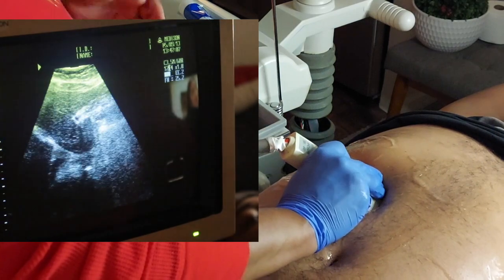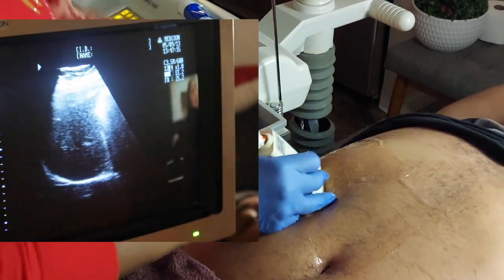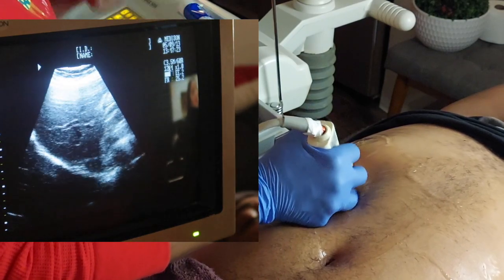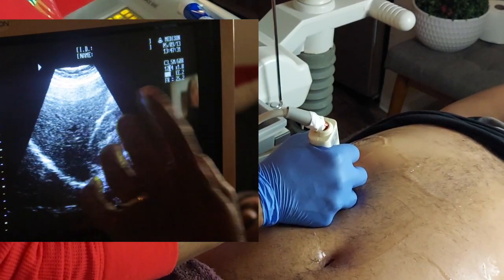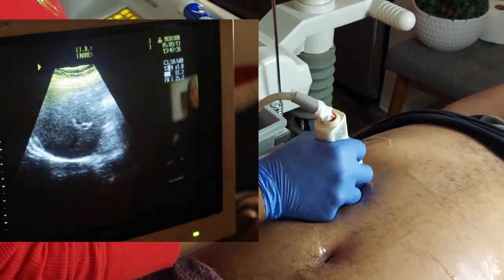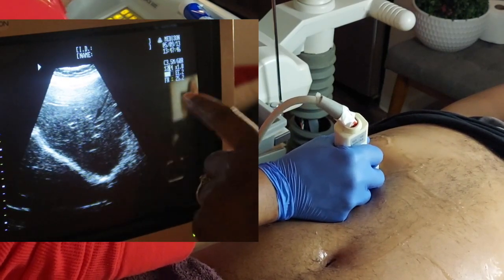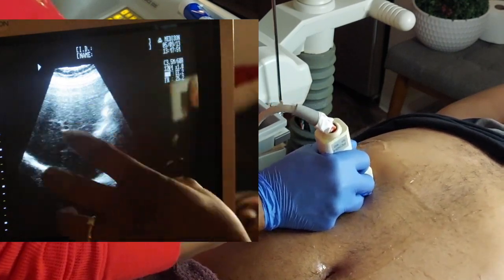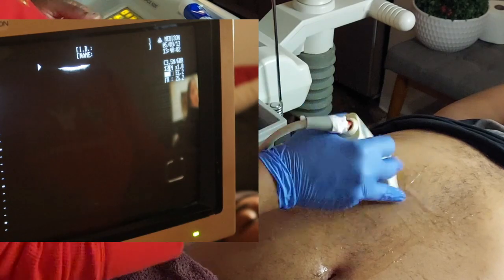Isn't that beautiful? So you can do sagittal — this is the way I scan. You really want to instruct your patient: take a deep breath in and hold it. Instruct your patient to do what you want them to do, because a lot of patients will breathe right out and you don't want that. You want them to have a stable image so you can get the best image quality. What if I was looking at something and I didn't want to move my probe? I wanted that patient to take a big breath in and hold it, so I know where my landmark is and I'm not moving my probe all over and losing where I was.